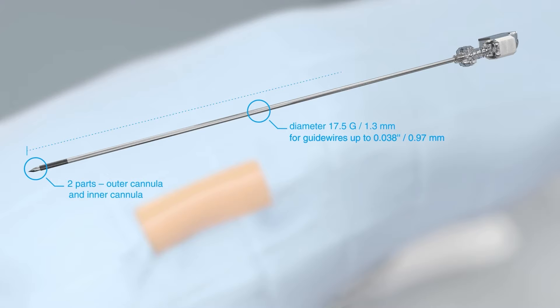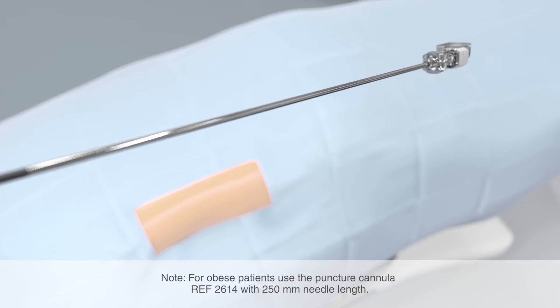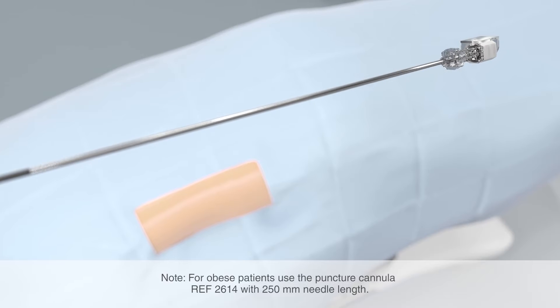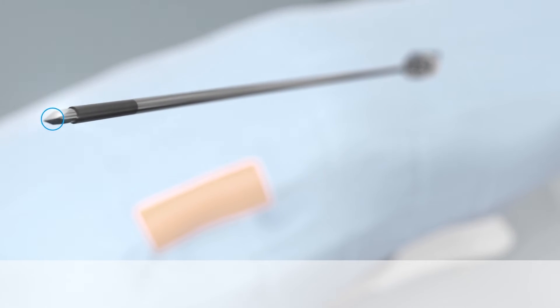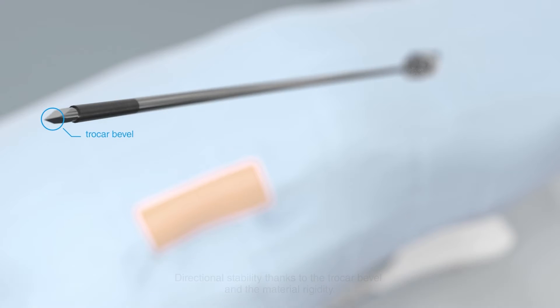The needle length of the puncture cannula is 185 millimeters. For obese patients, we recommend the puncture cannula reference number 2614 with 250 millimeter needle length. Both are completely radiopaque. The trocar bevel reflects ultrasound very well. The special bevel in combination with the material rigidity guarantees precise puncture. In addition, the roughened tip ensures good visibility under ultrasound.